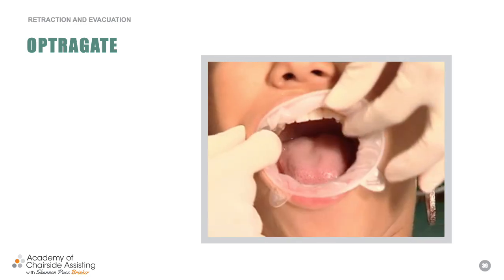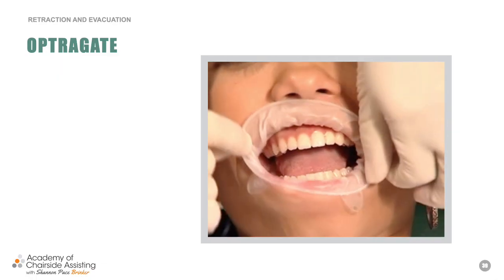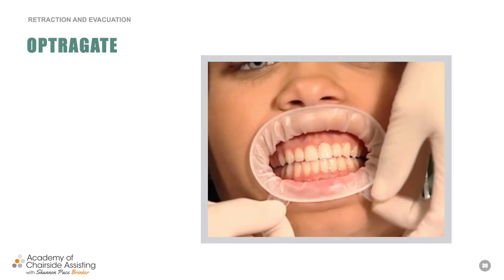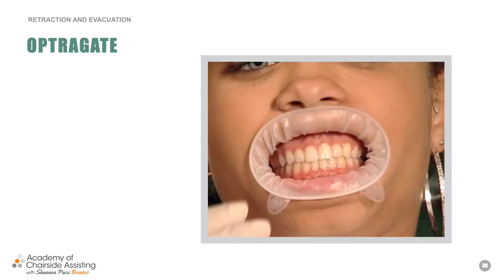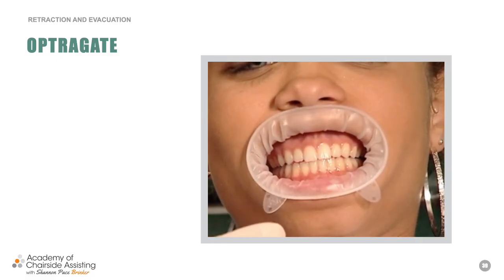There we go. And bring your teeth together. It's going to kind of go just up, like that. And close just a hair. Just like that. And you can kind of pull it. So if you're taking photographs, or if we're doing some bonding, we did some bonding on one of Haley's front teeth, it really works really well. Just open and close just a little bit. Does that feel pretty comfortable to you?